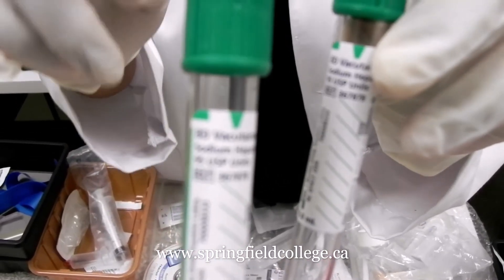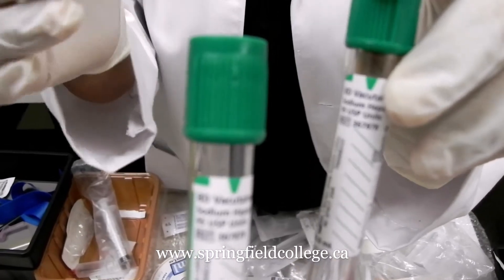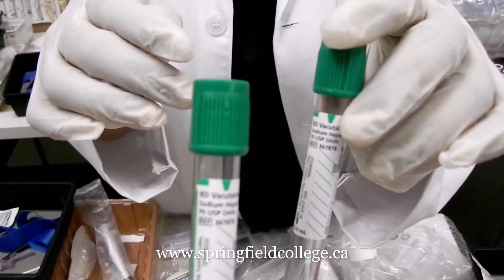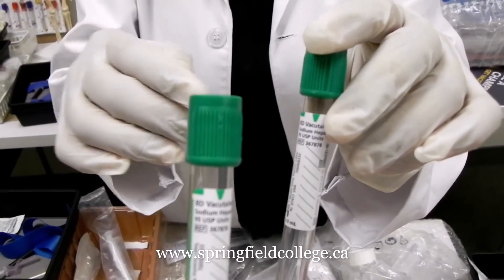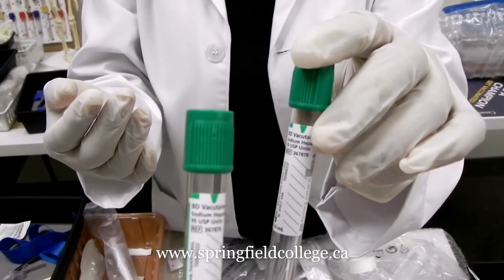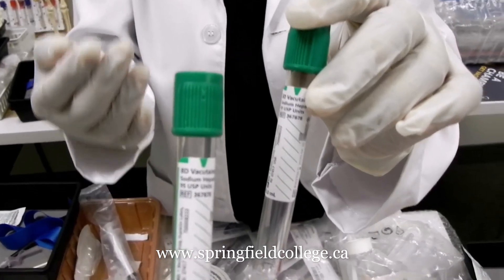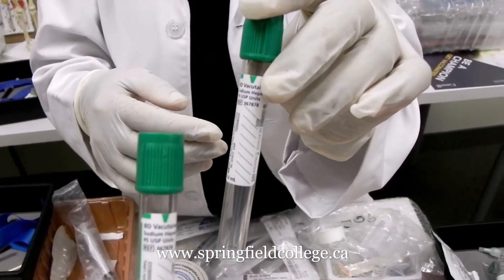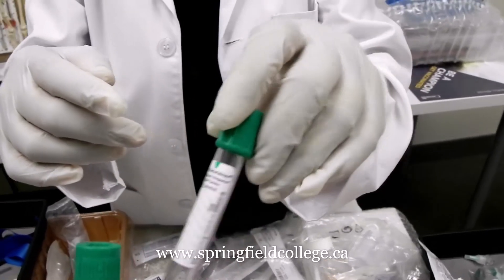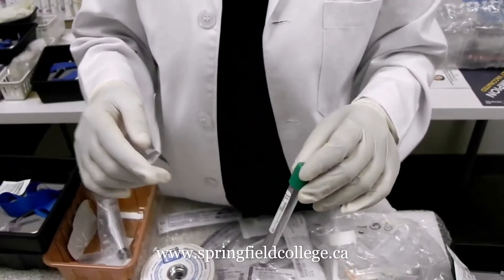We can use the green heparin tube for quick results in toxicology — for example, if somebody consumed poison and we immediately want results, we can use this tube. So this is the green heparin tube.